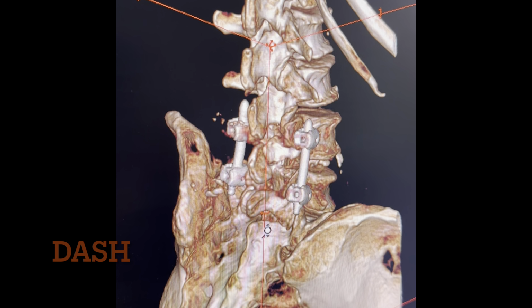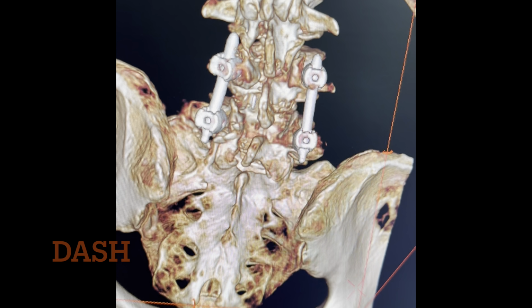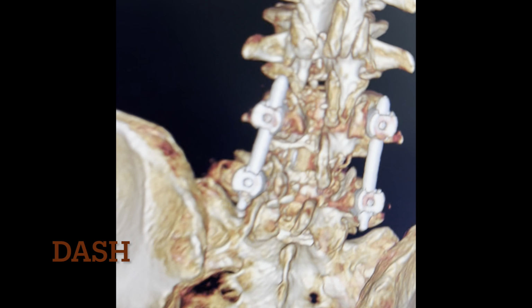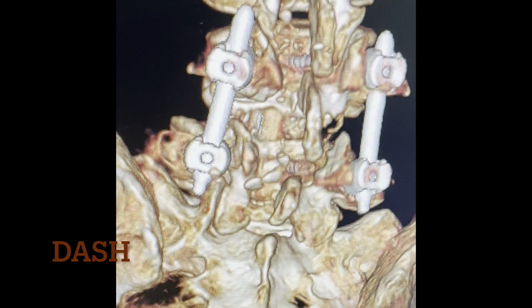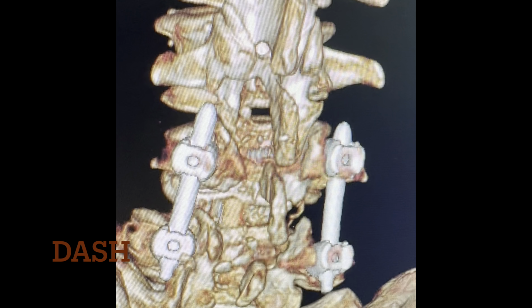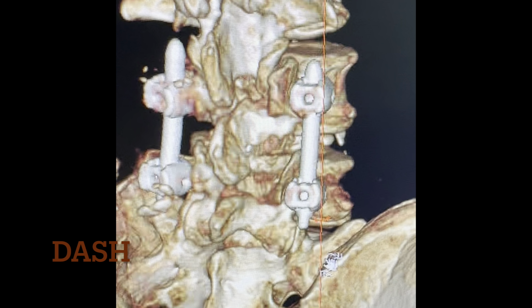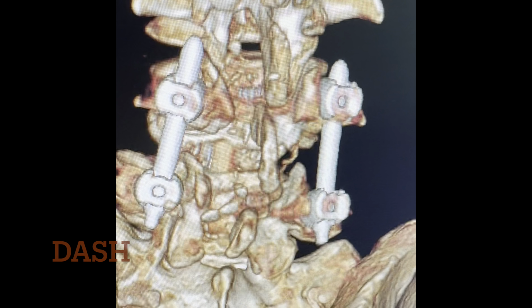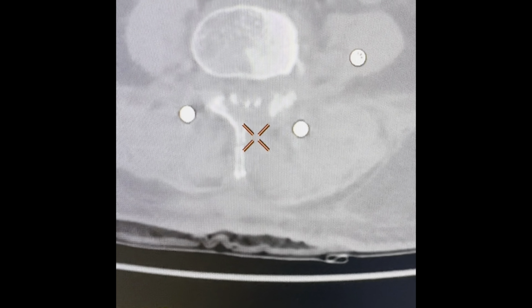Now you can see the final 3D recon of the post-op CT scan. You can see at L4-5 I have done a fusion, and you can see L3-4, L4-5, L5-S1 all hemilaminectomy has been done and connected. This is only possible with this diverse endoscopic way, which is unilateral biportal endoscopy. Thank you so much.